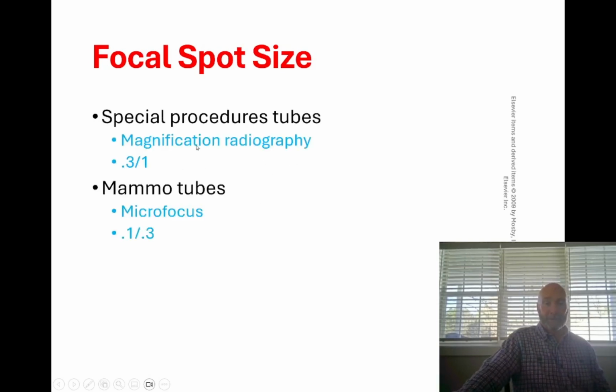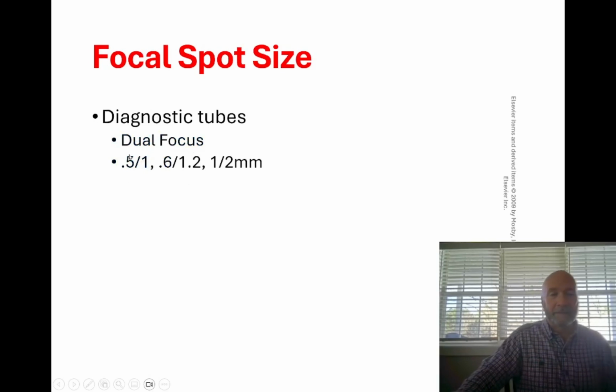We do have special X-ray tubes where we need a higher resolution than what a diagnostic tube gives us. So going back to this, this is really a pretty sharp focus X-ray tube for a diagnostic tube. Most of your X-ray tubes are going to be somewhere around one of these two.